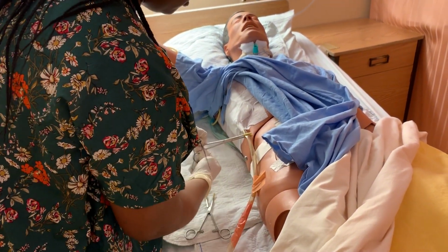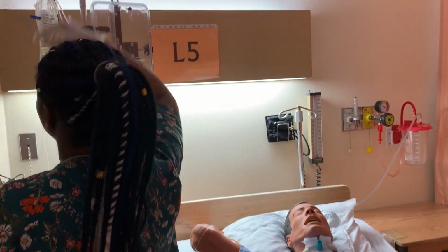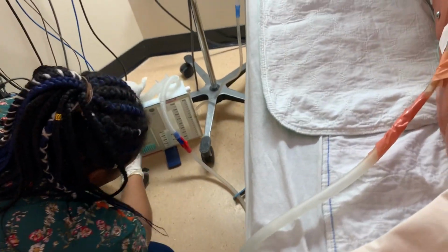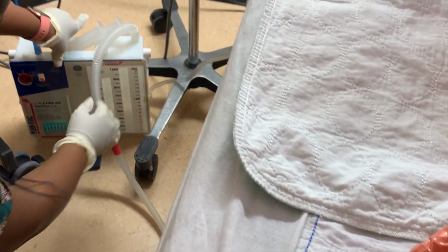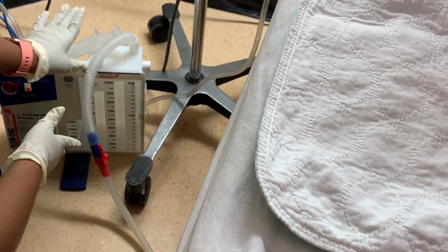So I'm gonna take this off. He also has a clamping forceps here, so I'm just gonna put it back on. Coming back down here, I have to check my water seal chamber. There should be gentle tidaling as the patient is inspirating and expirating. Also, my patient has a pneumothorax, so it's meant to be air that is going in here.